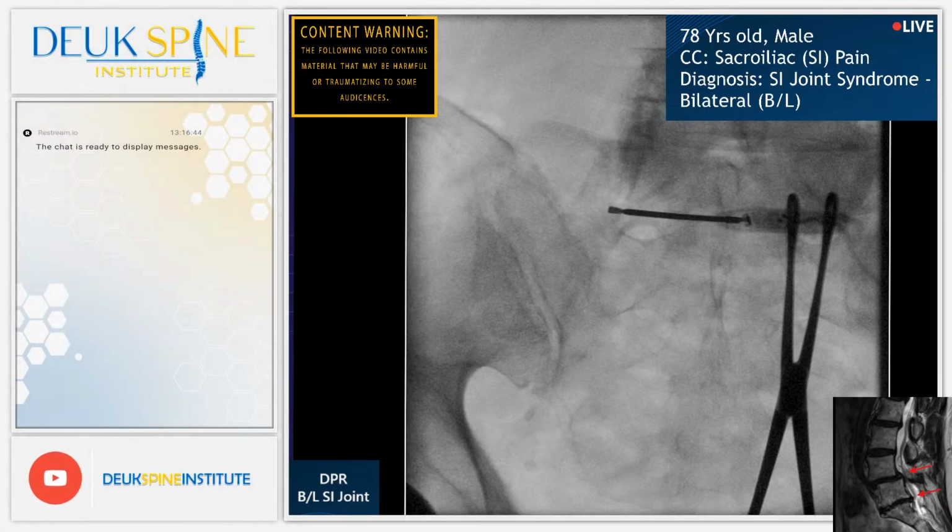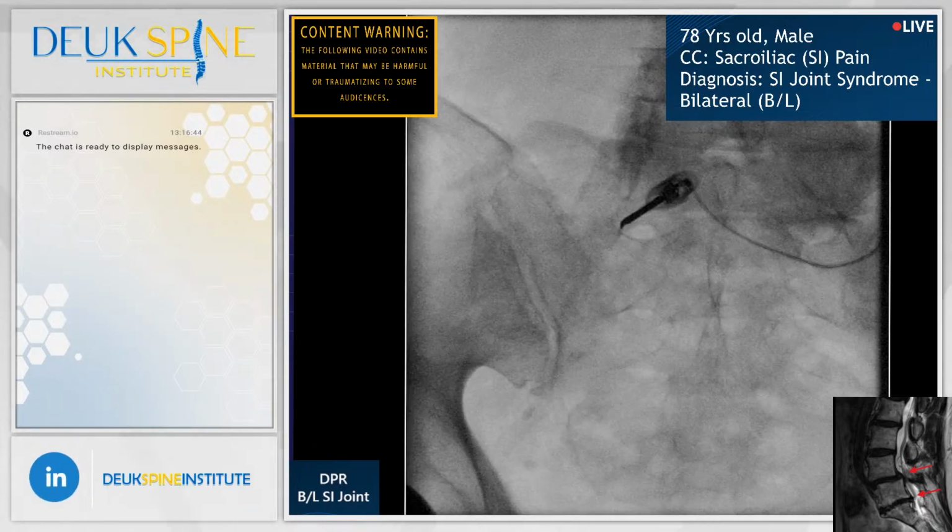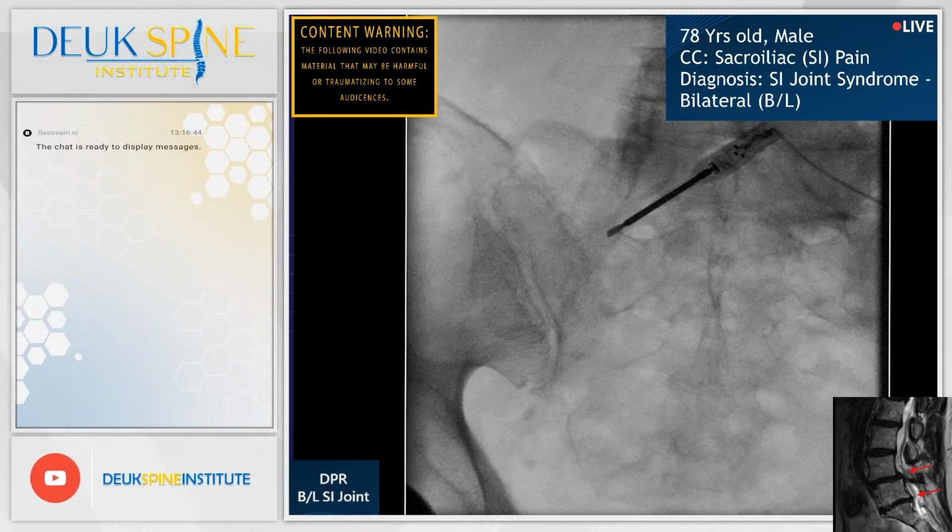If you look at the medial surface of his iliac bone, show them the medial surface. Come down. Look at all that irregularity. That's all calcified ligament. That's why we're having trouble. His ligament is all calcified. Shot. And it's literally pushing me medially. Shot. Making it difficult to get this thing done.